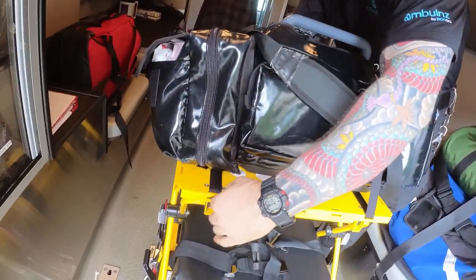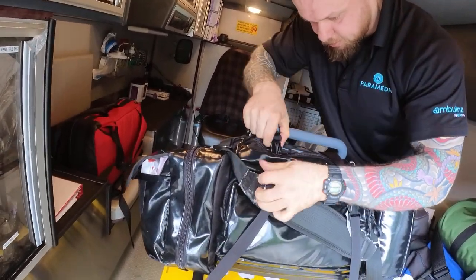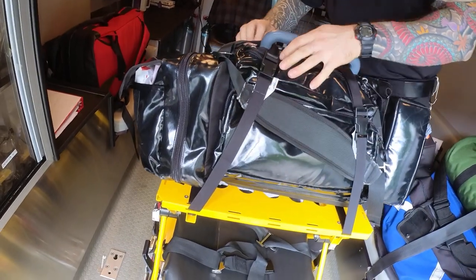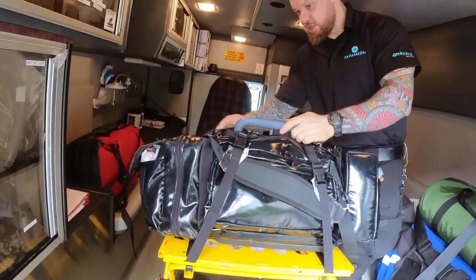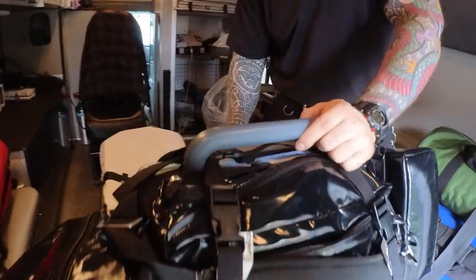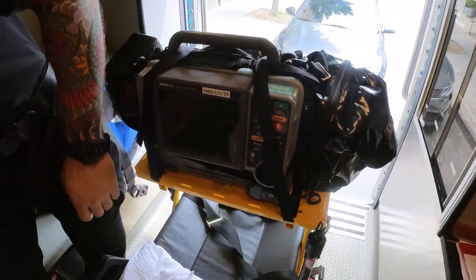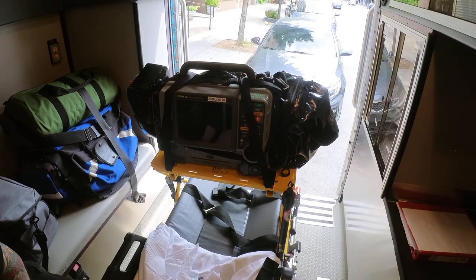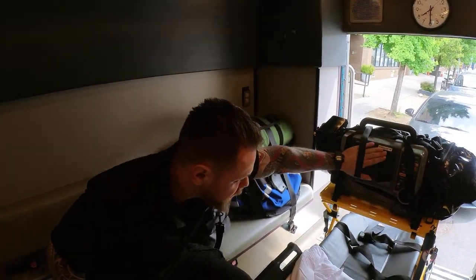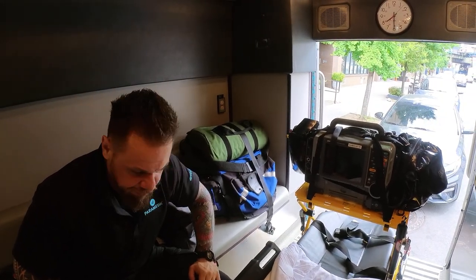I run this strap under and make sure it's tight, then run the other side under as well. You want to make sure you have good visibility of the screen — if I'm sitting here looking at the patient, I also want a clear readout and access to all the controls. This completes the standard assembly.